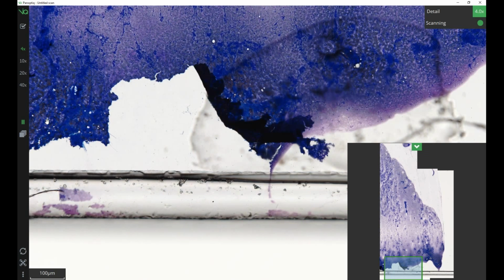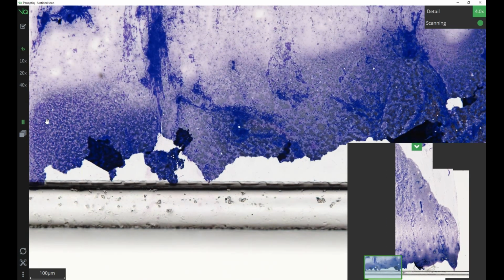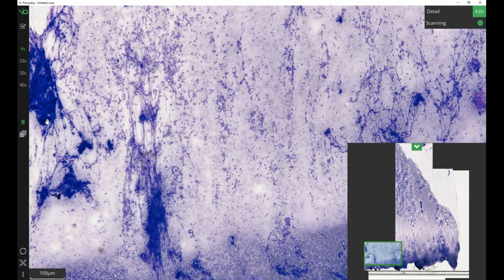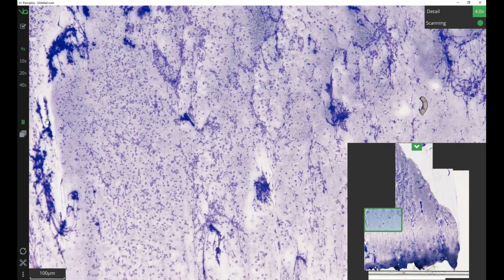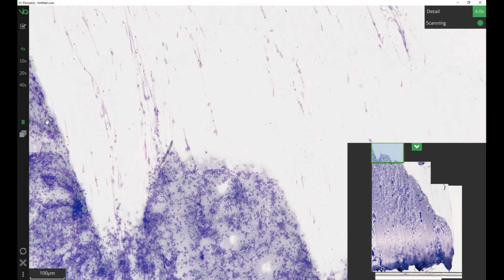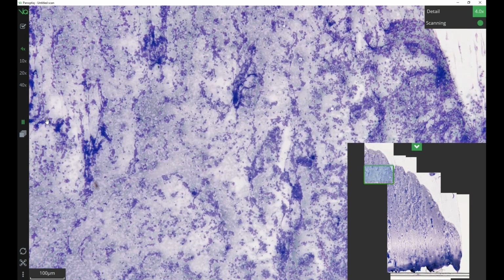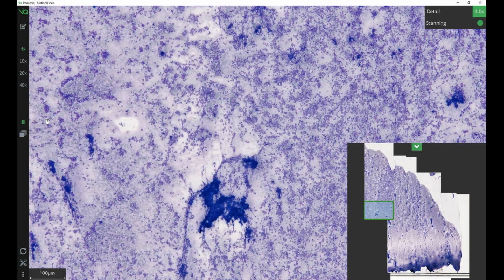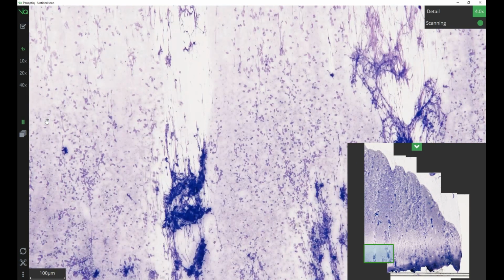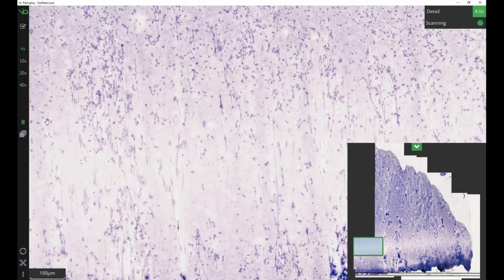At any time after I've begun this procedure, Dr. Hanna can come online and begin viewing as well. I would just be scanning and waiting for him to come online. Hi James, I see the FNA has been performed and the slide prepared, so I'm ready to begin.